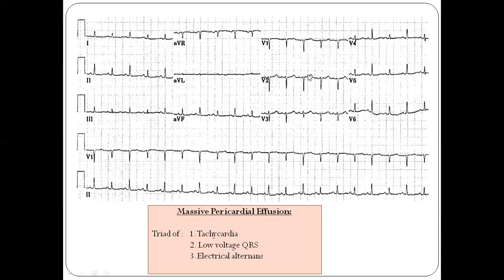An important characteristic visible here is electrical alternans — notice the morphology of the QRS: one beat is large, then small, then large again, alternating small and large. This alternating pattern is characteristic of massive pericardial effusion or cardiac tamponade.